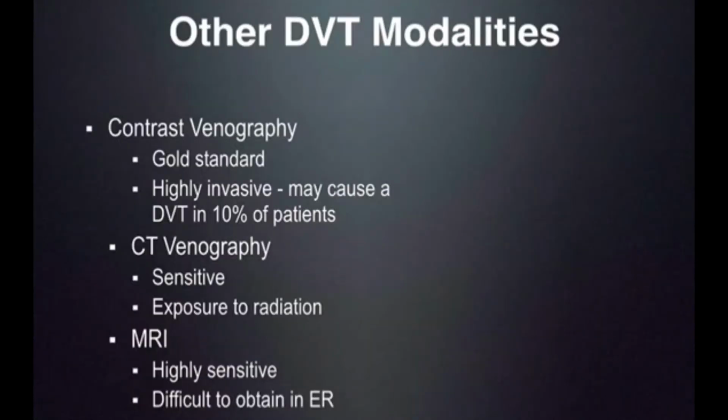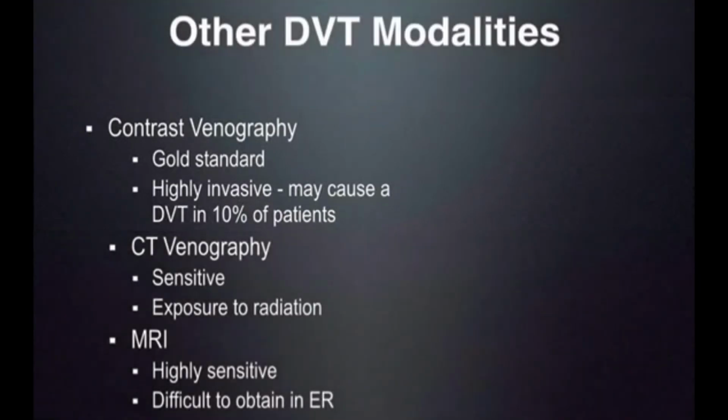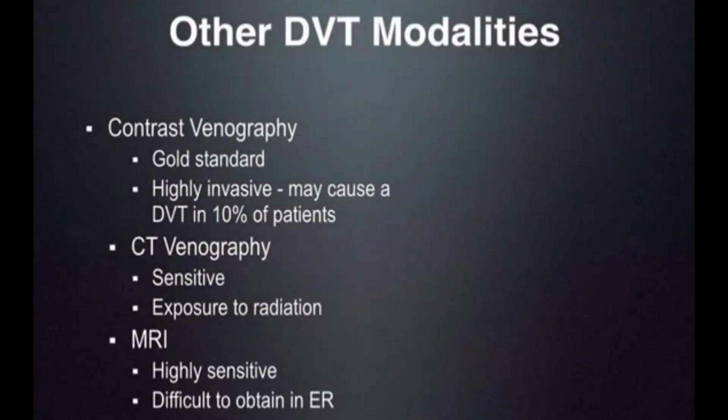Now, modalities that were used prior to the introduction of ultrasound, such as contrasted venography, used to be the gold standard. It's highly invasive, and in 10% of patients that undergo this, they actually develop a DVT. CT venography is very sensitive; however, the exposure to radiation is often not necessary. And then MRI, though highly sensitive, is very difficult to attain and very time consuming. If you are a physician working in a resource-limited setting, in all likelihood you will not have access to these diagnostic modalities anyway. Therefore, ultrasound becomes the go-to diagnostic tool.